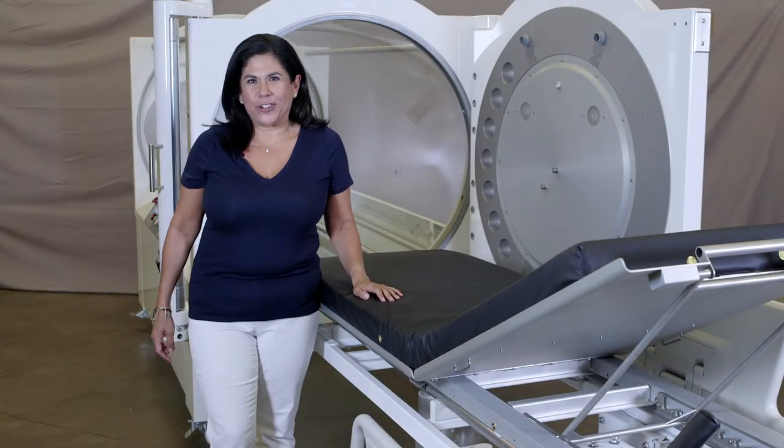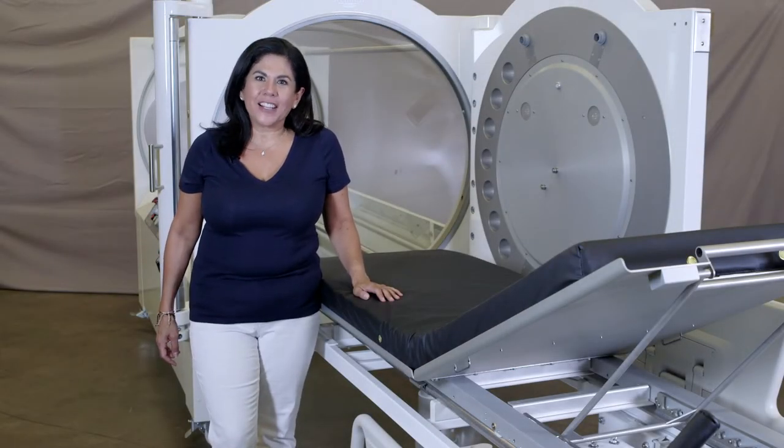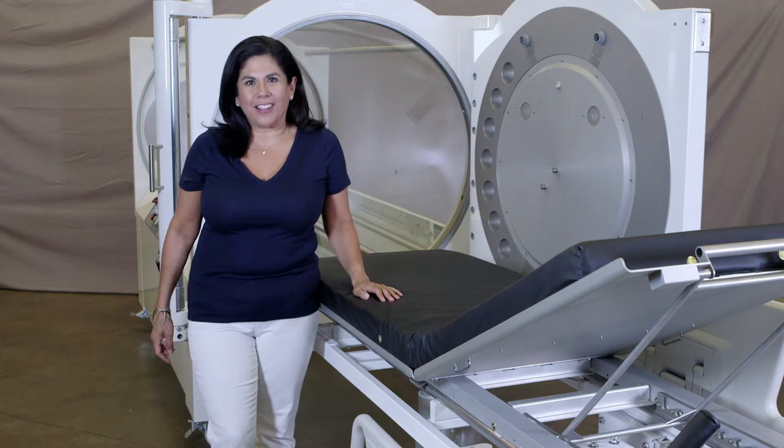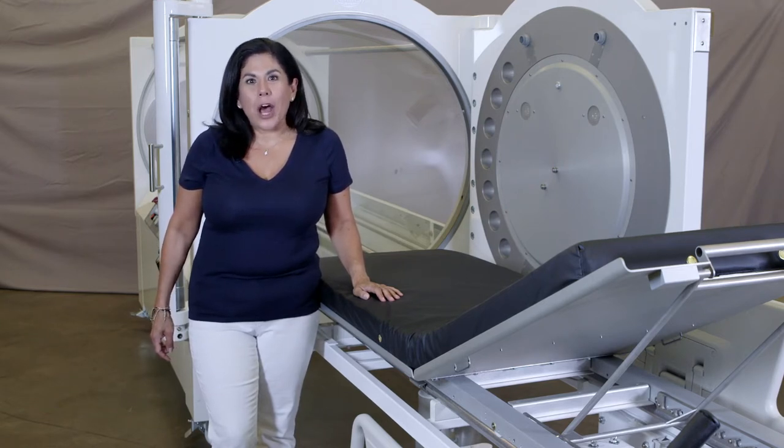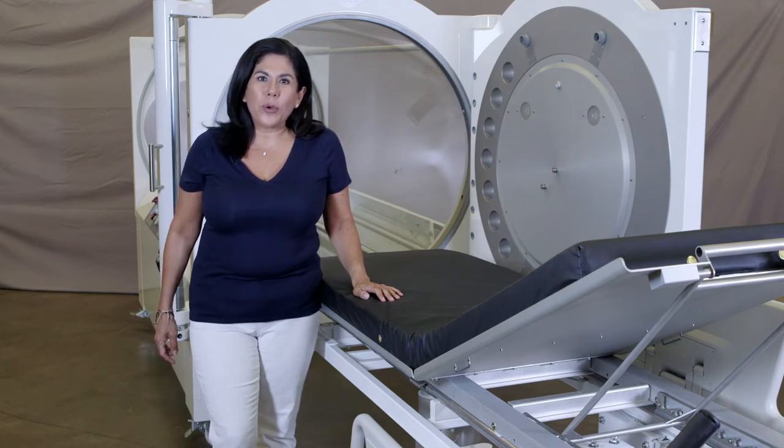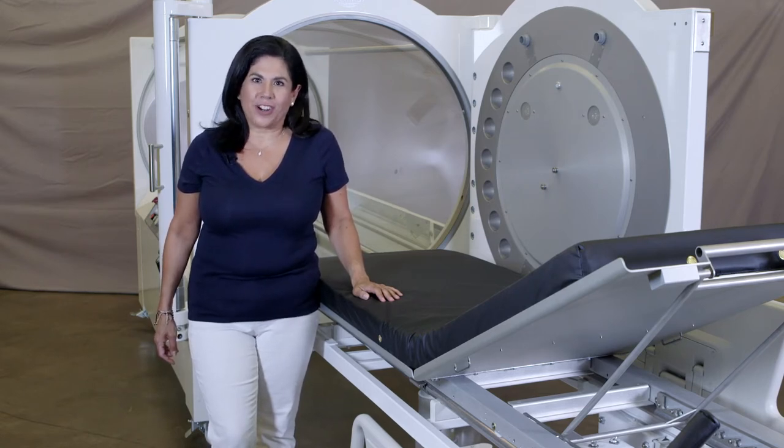Hi, welcome to Seacrest Industries. My name is Monica Gutierrez, and I'm the Director of Technical and Client Services. Having been at Seacrest for over 16 years, we are very excited to bring to you our newest product, the eGurney. We wanted to give you a how-to video to show you the ins and outs and how to make the most of your and your patient's experience.